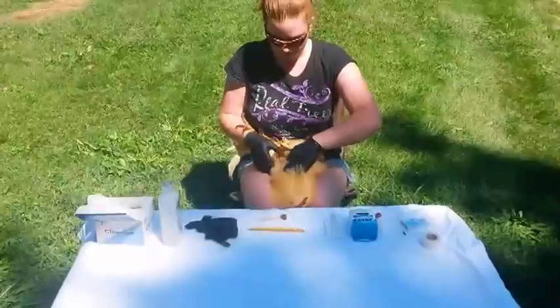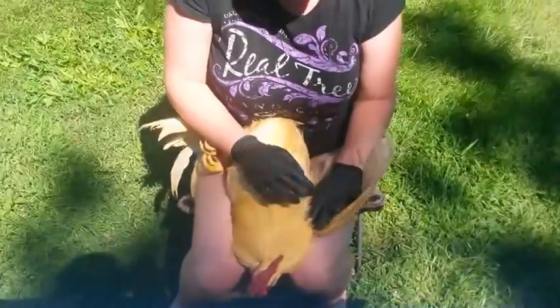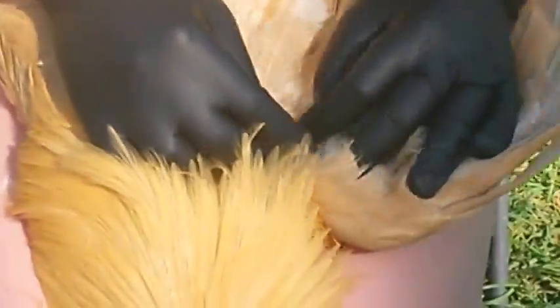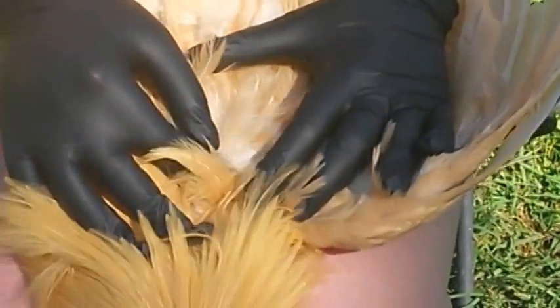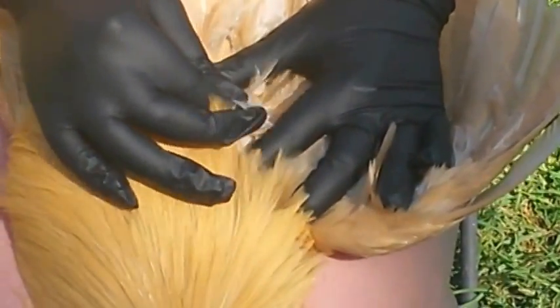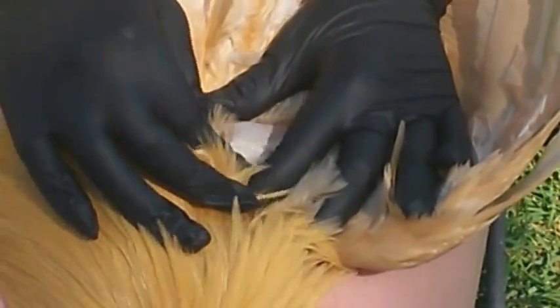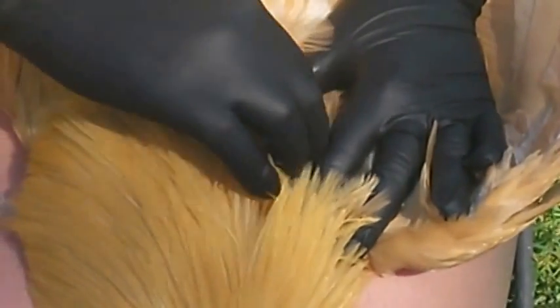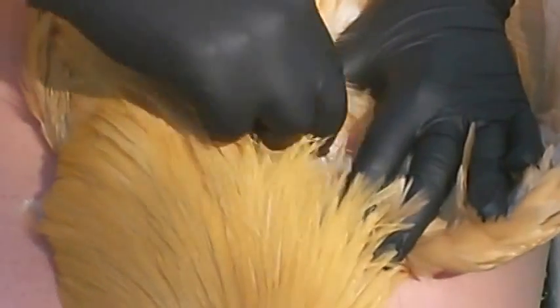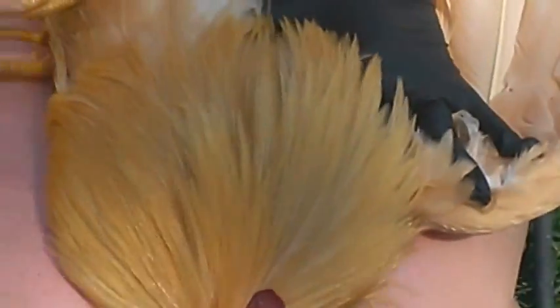Alright, then what you're gonna do is you're gonna open your bird's wings. And as you open it, it's gonna be a feather mess in there, so you're gonna find a good vein — there's a decent vein. You may have to pluck some feathers away; it doesn't usually bug the bird, they don't jump. Then you want to get your prep pad and make sure that you clean the area that you're gonna be poking them from.